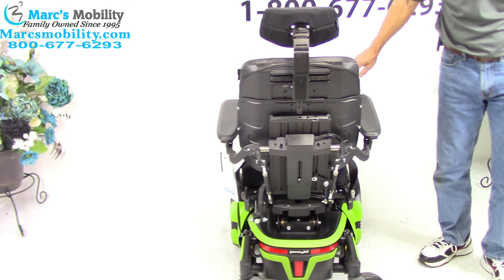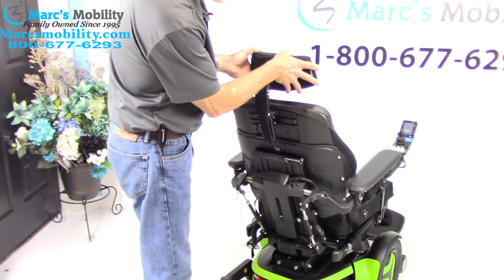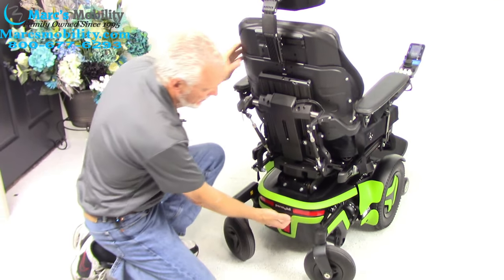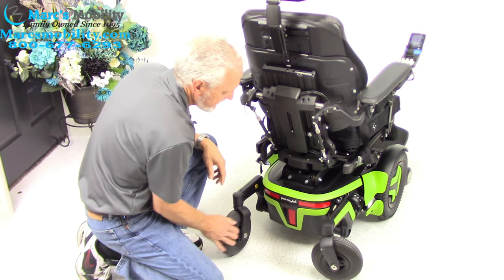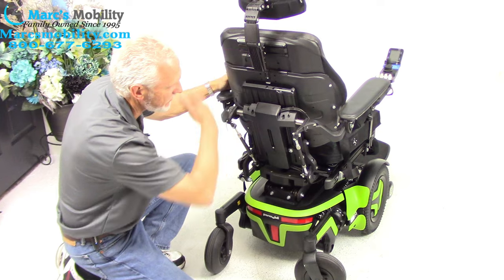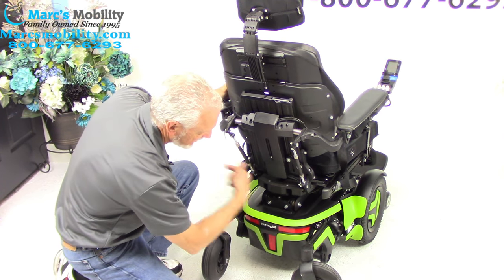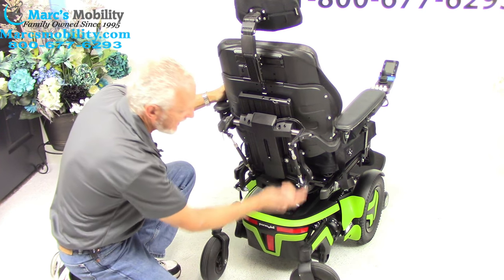Let's look at the back of the chair. We have a fully adjustable headrest right here. We have a power button right here — when we ship these chairs, we turn the power off right here. Power is off completely on the chair. So you need to come here when you receive your chair, push the button to the left, and the power is back on.